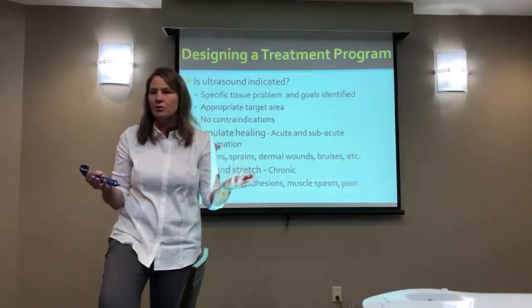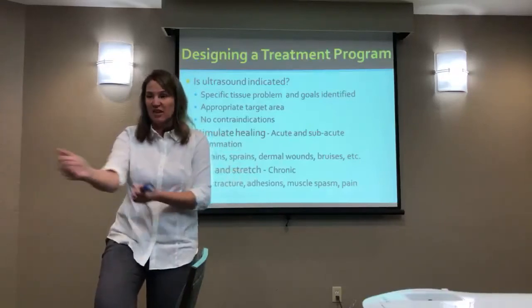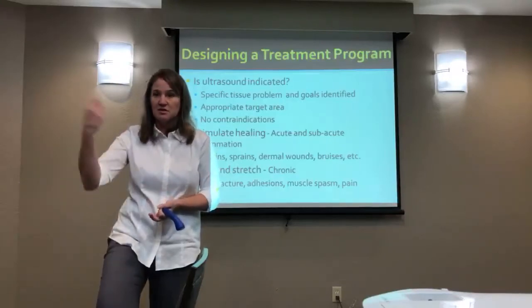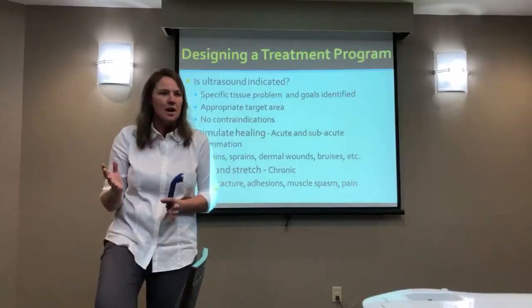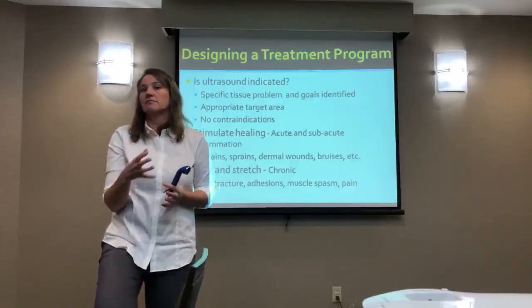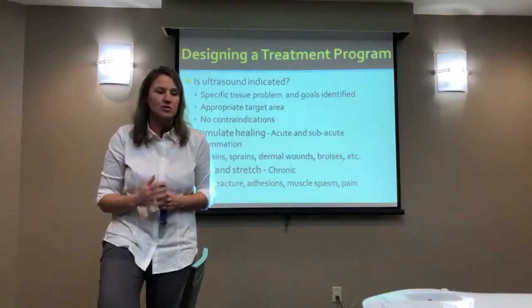Now, I didn't have a medical problem, anything like that. I am right-handed. There's potential that I, you know, use this arm more and caused it to take longer, or we could argue that it should have gotten better faster because of all the muscle activity, but regardless, it was a really kind of cool opportunity to try something. So again, that's the kind of scenario that I technically talk to people about and I might utilize ultrasound for.